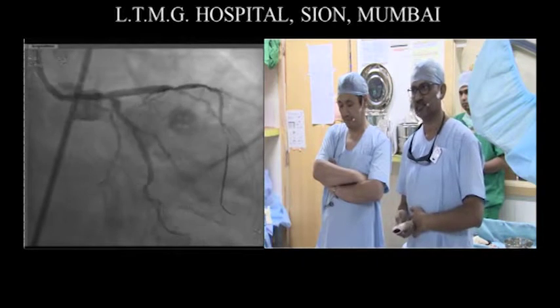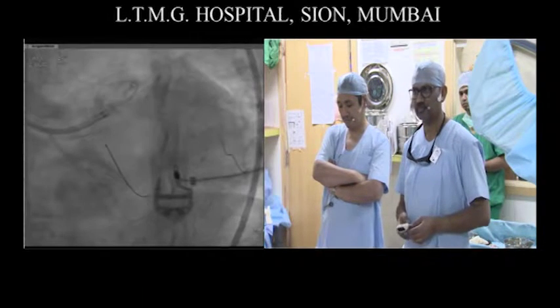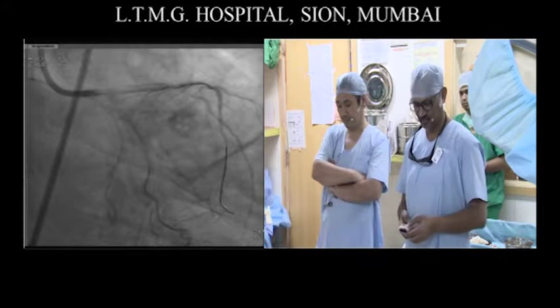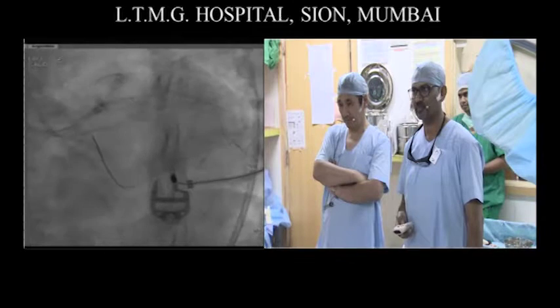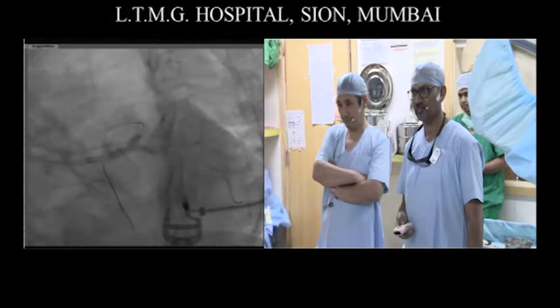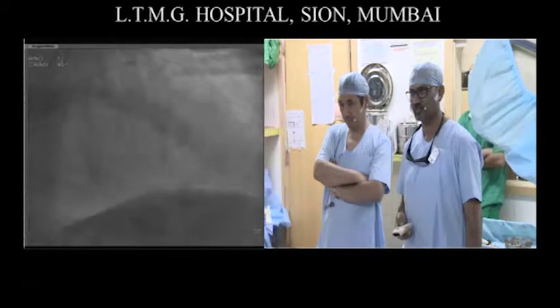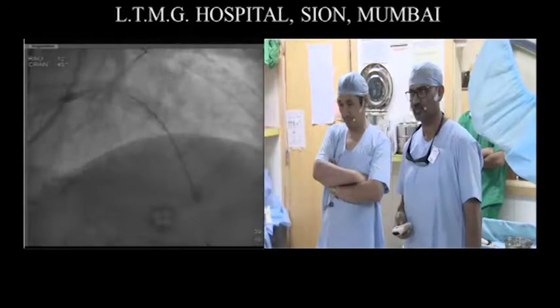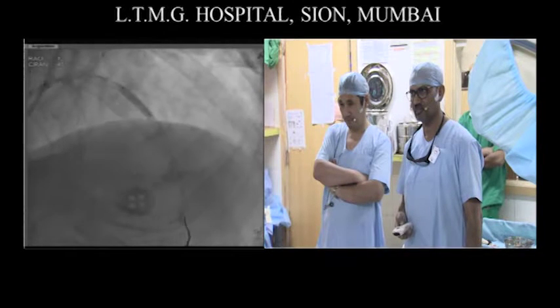Dr. Mahajan and Dr. Hamasaki can also jump in for that question. It is an old drug which we are used to having right from the Cypher days. Do you think sirolimus is okay on the BioMime, or we need everolimus on BioMime?